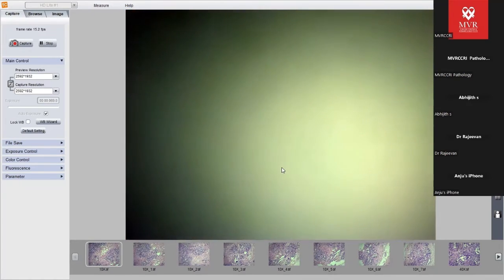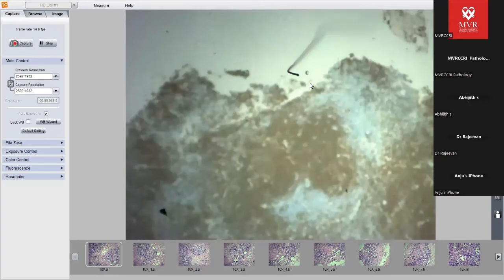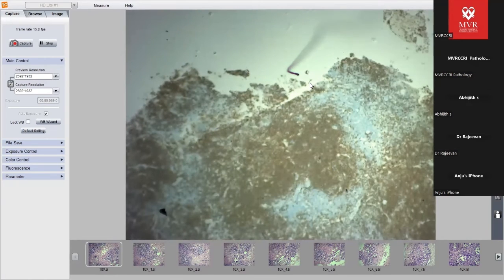What about CD20? CD20 positive, quite bright positive. What is that? Is it within the B cell nodules? Yes, the cells are within this large B cell nodule, right? So the background, you should never ignore the background. It is a large B cell nodule. You have seen the large cells within this nodule.